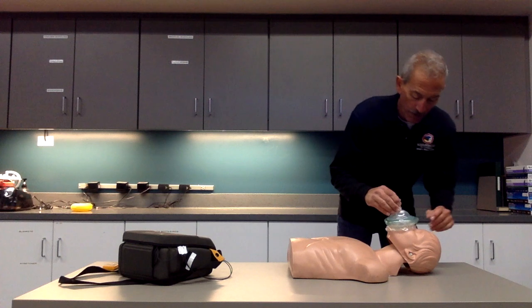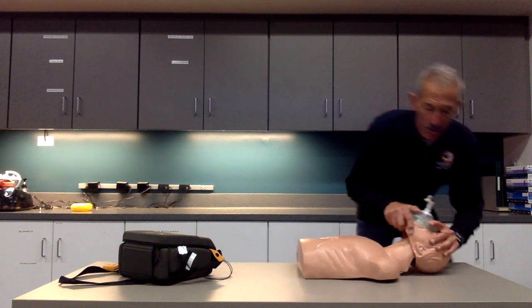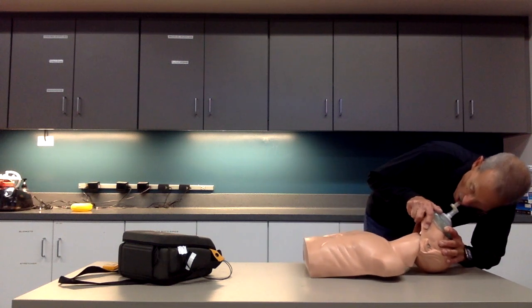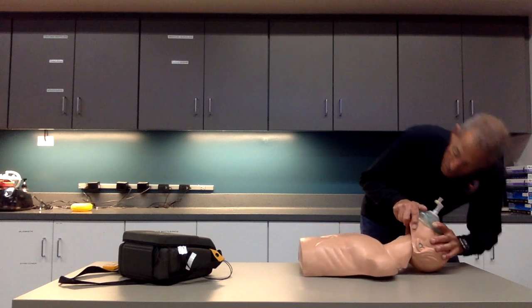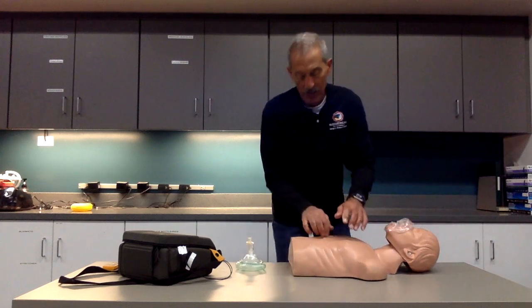And provide two ventilations, one second each. We continue this process for two minutes.